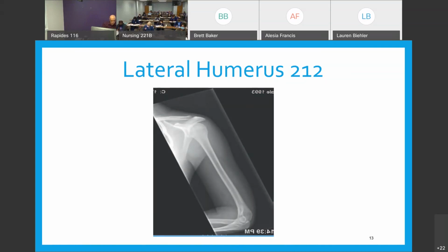And if you look at your images on that page on figure 5.153, 154, you see the difference. But the outcome is going to be the same as long as we're cognizant of the epicondyles being perpendicular. Very good. Perpendicular, because it looks like an elbow, lateral elbow, doesn't it? Everybody see that?